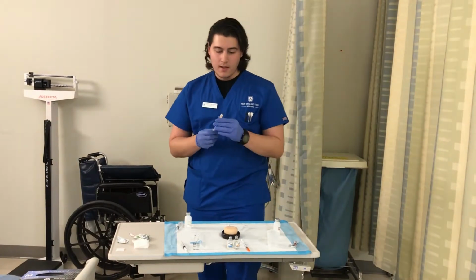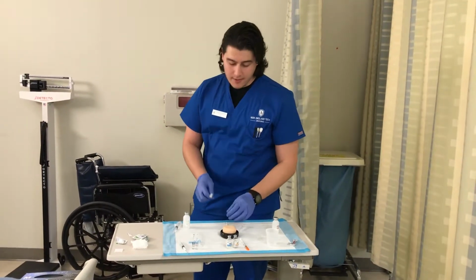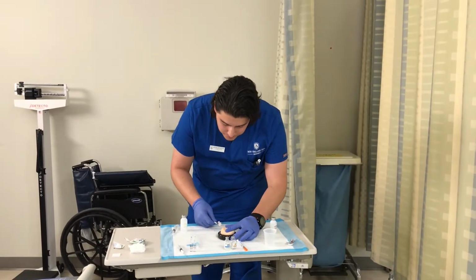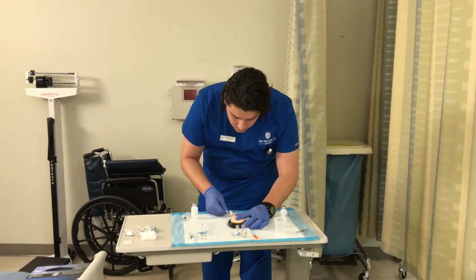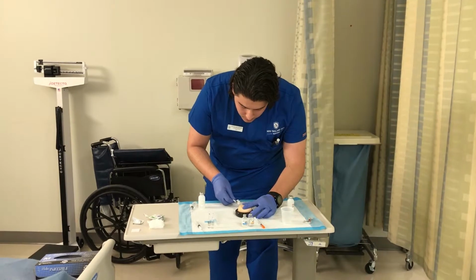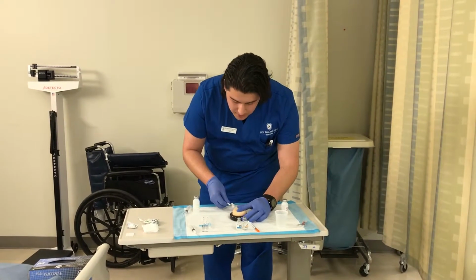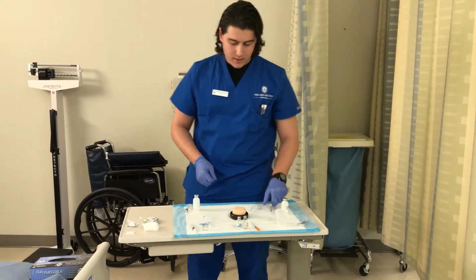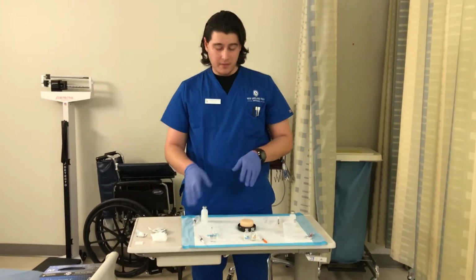Okay. And for this one, you're going to insert it under the skin, 5 to 15 degrees. You're going to stretch the skin out, and inject the medication, and you want to see the bleb there. Okay, again, cleaning the site.